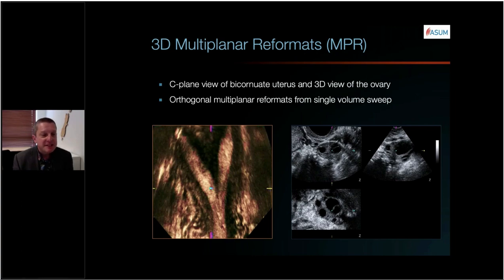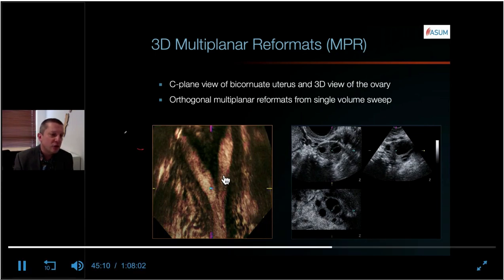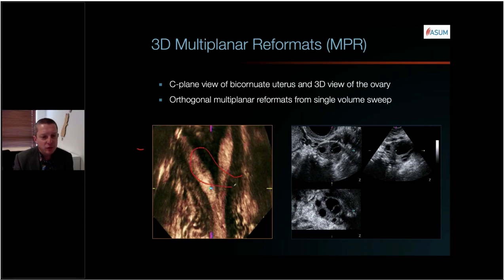In fact, some systems nowadays offer not just plain sectional imaging, but also curved volume. So for instance, if this bicornuate uterus is also antiverted, having this sort of contour with a curved endometrium, nowadays you can define a curved plane of section for your 3D imaging, so that you're literally slicing along the endometrium, which is where the diagnostic information is.